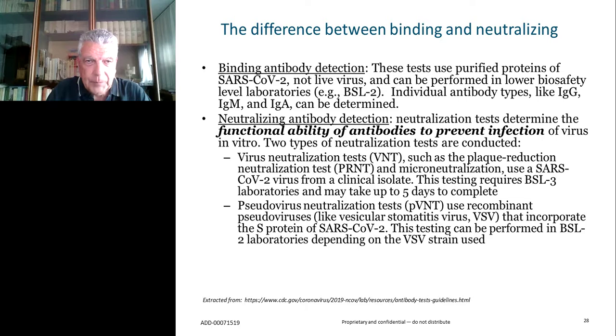And this is why. There is a difference between binding and neutralizing antibodies in that all assays that are in use now are testing for binding antibodies. Even if they target the spike region, the RBD domain or whatever, they will not detect the neutralizing activity, okay? They may be related, and indeed will be related to neutralizing activity, but that's it. If you want to check a neutralizing activity, you have to run viral testing.